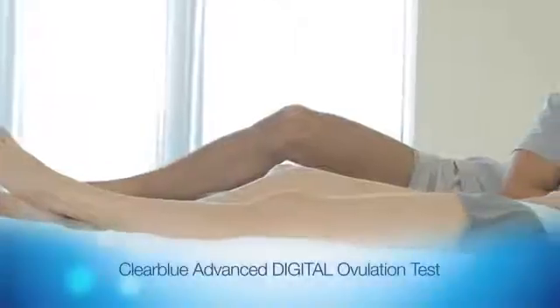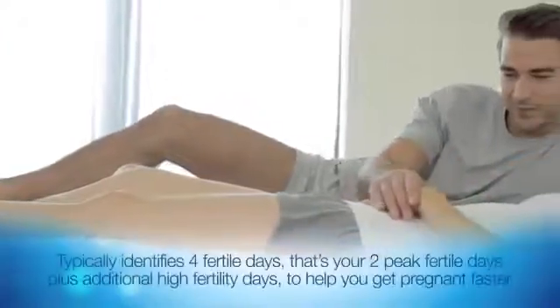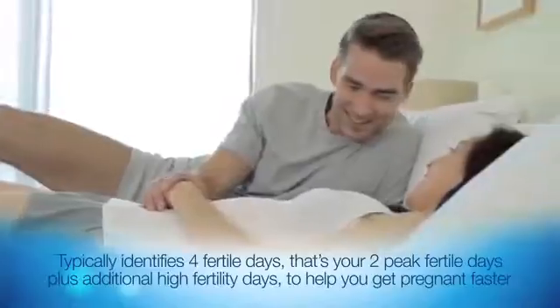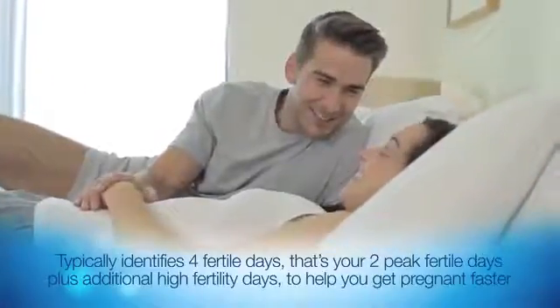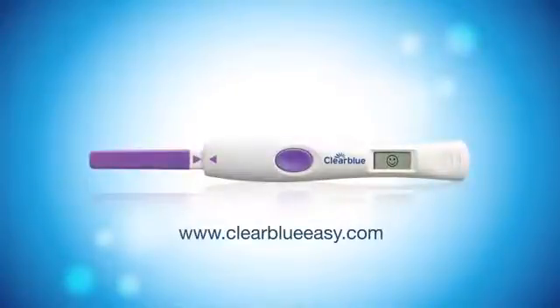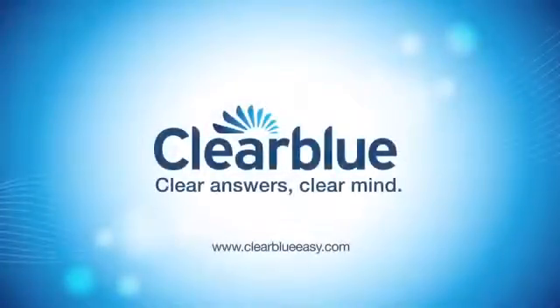Clear Blue Advanced Digital Ovulation Test typically identifies four fertile days — your two peak fertile days plus additional high fertility days — to help you get pregnant faster. For more information, visit our website. Clear Blue: Clear Answers, Clear Mind.